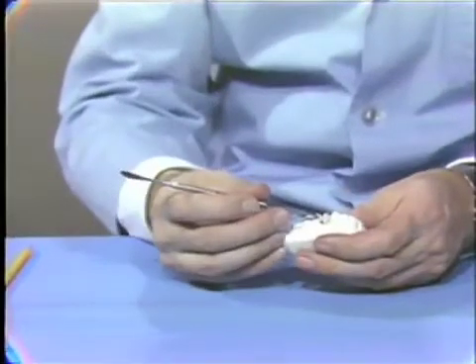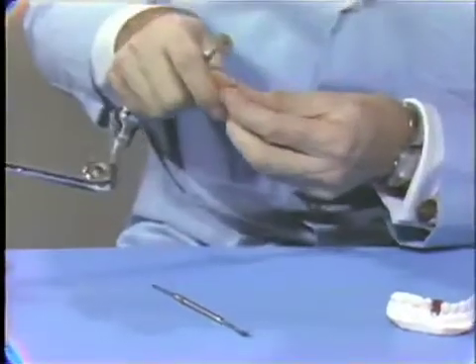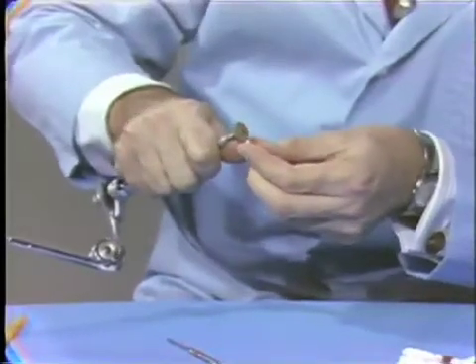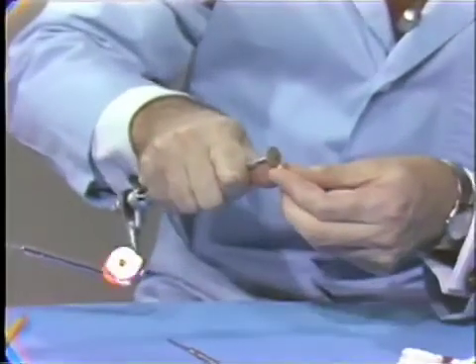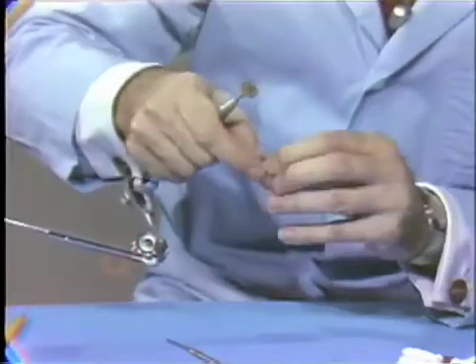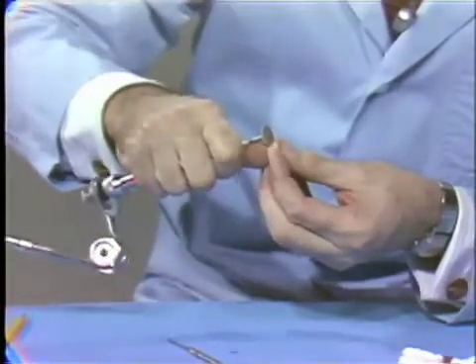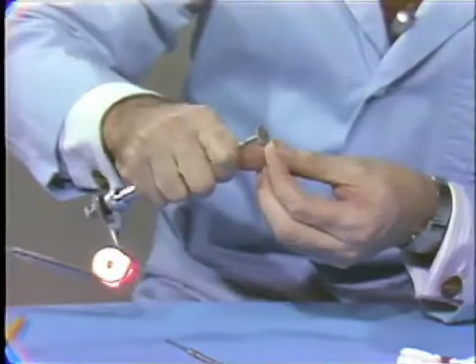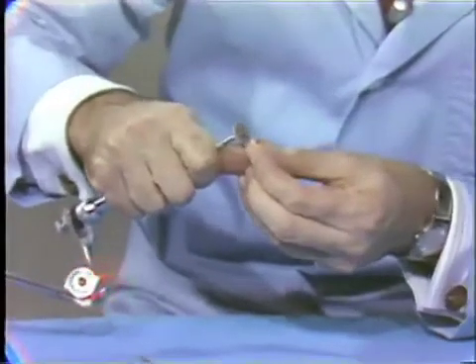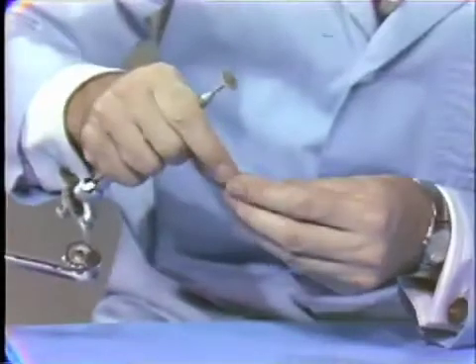The next step then is to grind the proximal surfaces of the pontic facings in order to open these embrasures. And this can be done with the same Derico grinding stone that we use to do the other adaptations of this facing. These stones cut quite quickly and do a very nice job without danger of fracturing or chipping the porcelain edge. And they're certainly well worth using in this situation compared with the regular green stones.